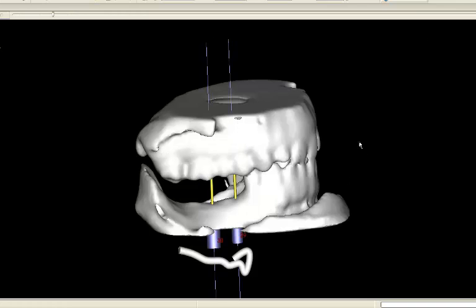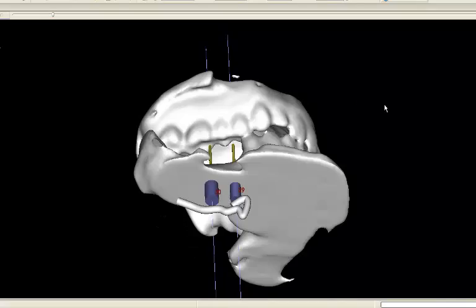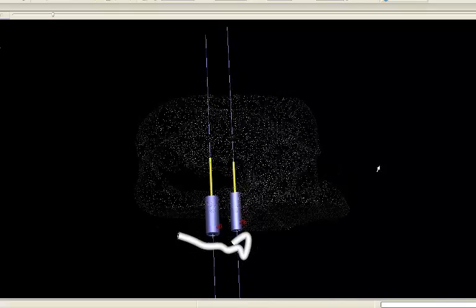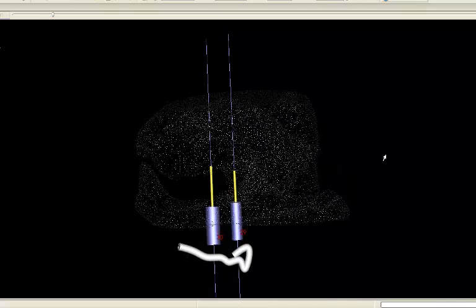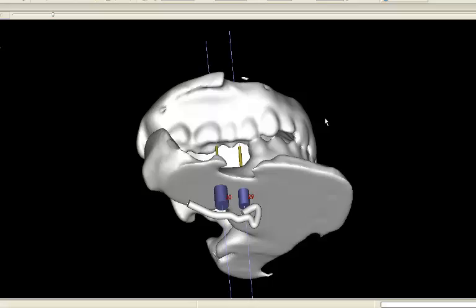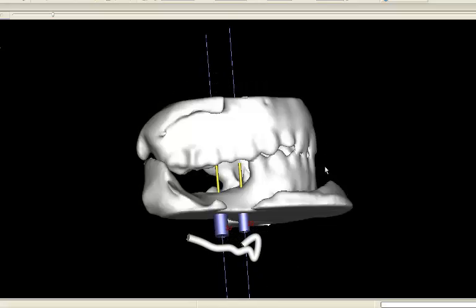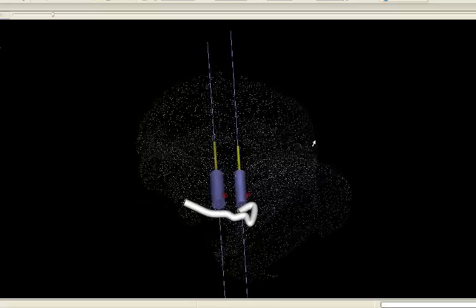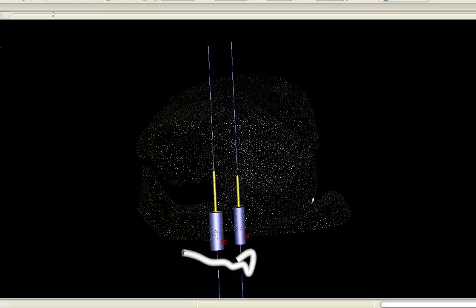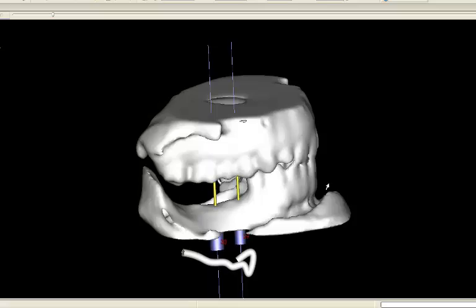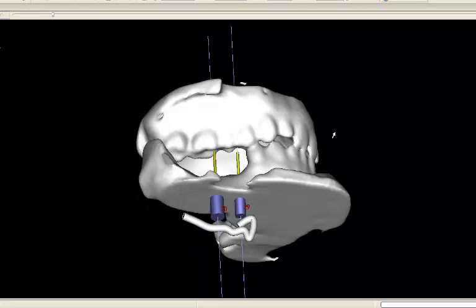Another example utilizes articulated models so that in cross-section the implants can be aligned with the lingual cusps of the opposing arch. In the cross-sectional views, the outline of the opposing teeth will be visualized.